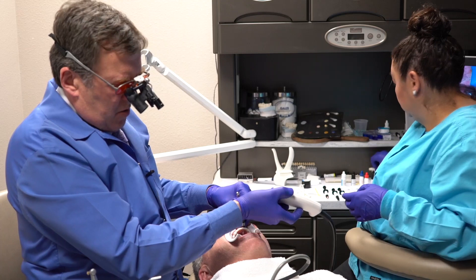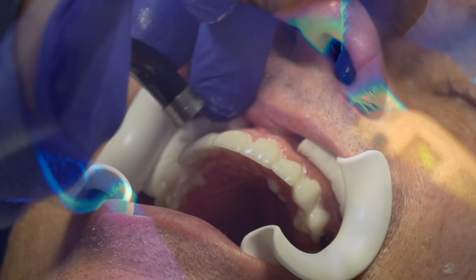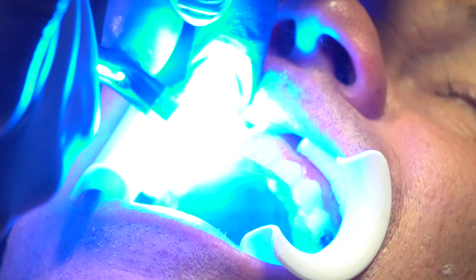I don't put the light directly on the surface — I back off. With this sapphire light, it's got the same energy at 10mm versus 1mm, so if I back off I can get the whole entire tooth in 5 seconds. I'll do an entire cure — 5 seconds per tooth — and you're looking pretty much darn good.